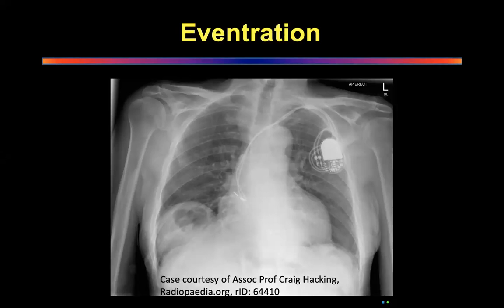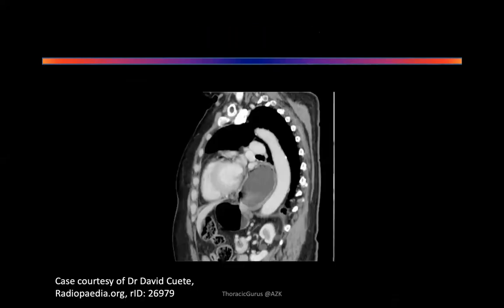Actually, this was an eventration. But you can call this a hernia as well because you can actually see bowel loops within it. You can get a medial side herniation and bowel loops. So I'm okay if you call this a hernia. That's not a problem. But then you need to investigate it a bit more. You need to get a lateral chest X-ray done and you need to do fluoroscopy. That's the main diagnostic test, and fluoroscopy will tell you whether the diaphragm is affected or not. Okay, happy with that? Yes, sir.